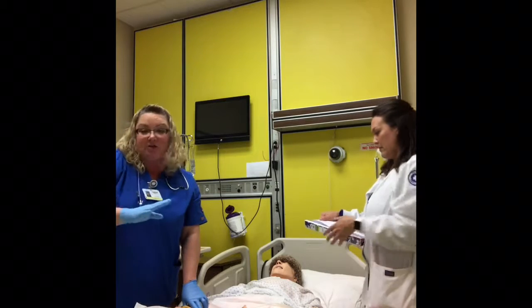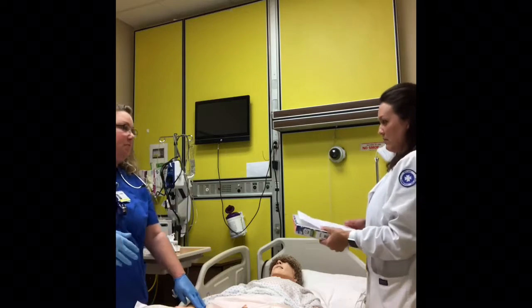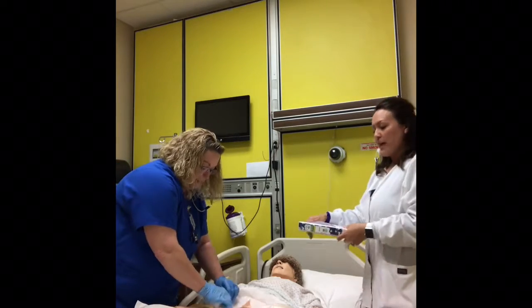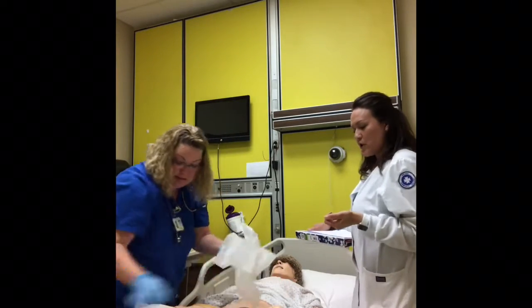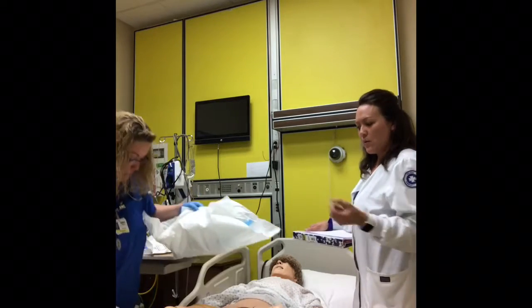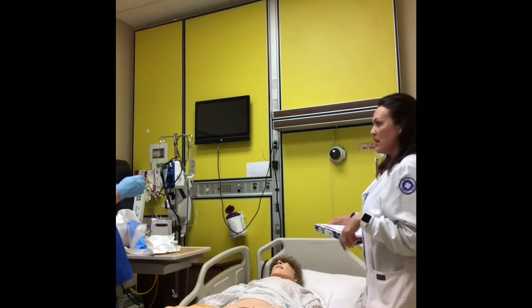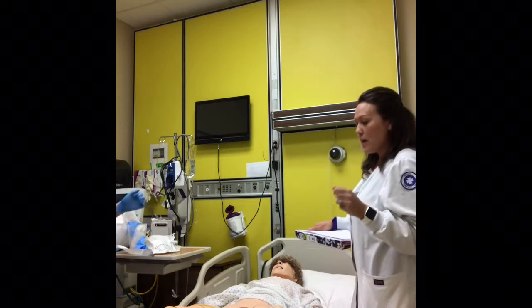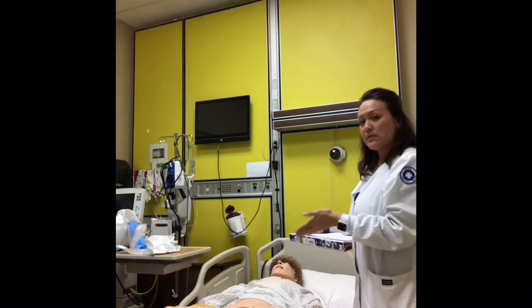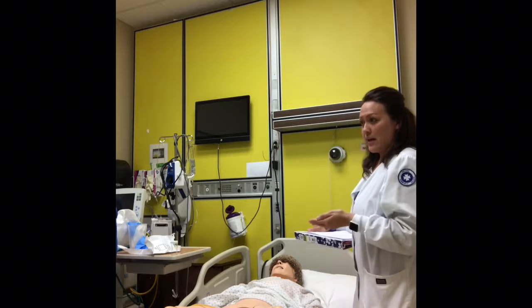Now there's a couple things that Janet wants to talk about when finding the right place and making sure that you're in the right place. The wink. Yeah. So if, while inserting the catheter, you do not see any urine flow coming out and the catheter is quite a bit advanced in, you probably are not in the urethral meatus, so leave the tubing there because you're probably in the vagina. Grab another catheter kit and then try again.